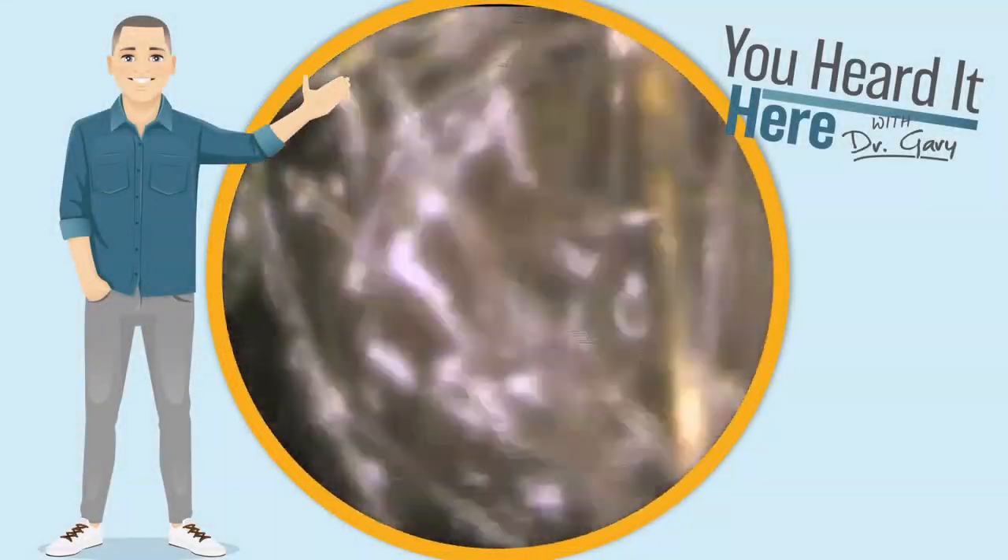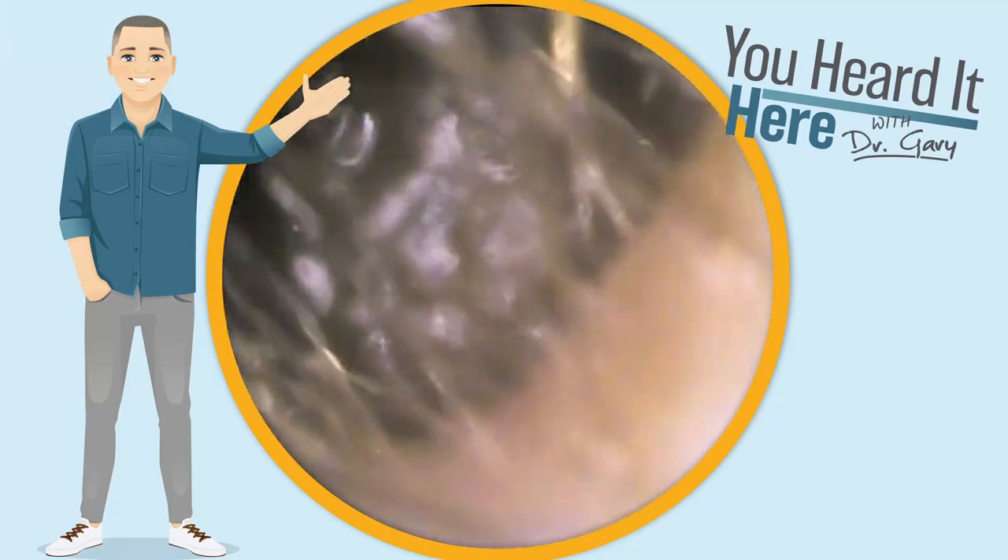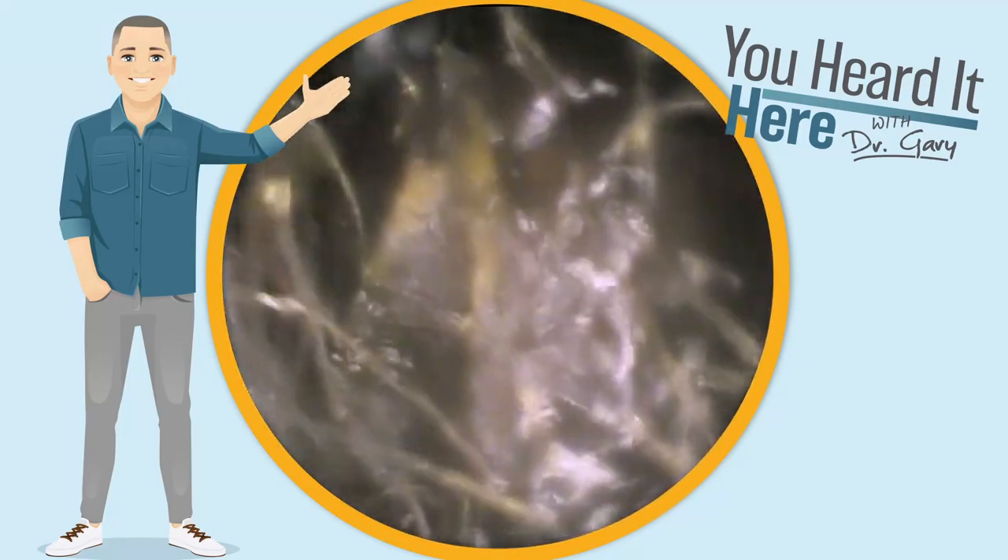Welcome back to You Heard It Here with Dr. Gary. Today we're going to look at four ears — two patients — and they each have very different types of wax.